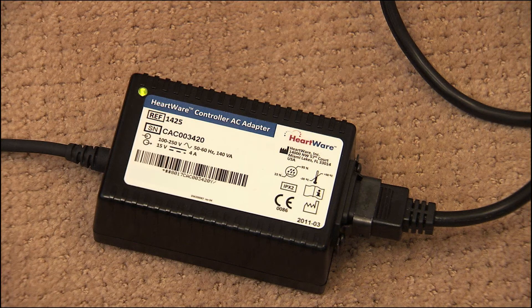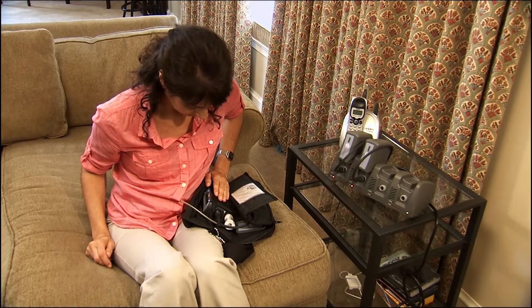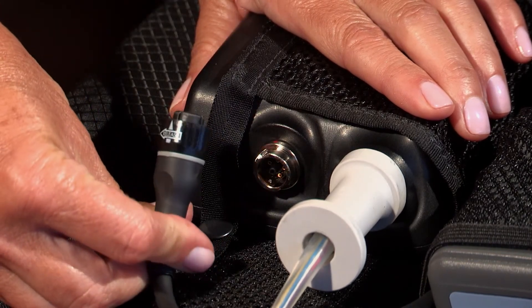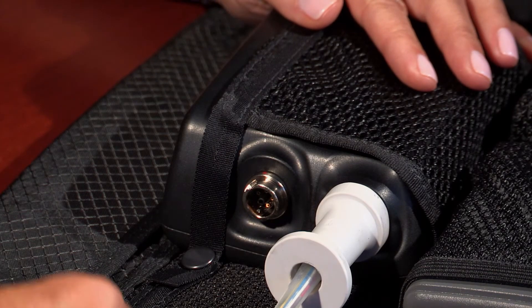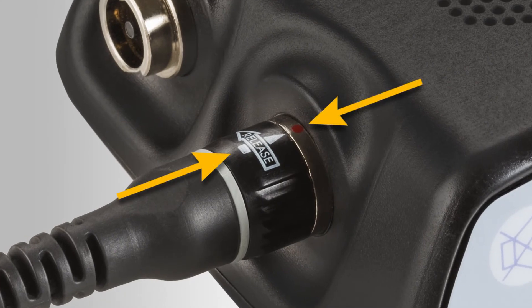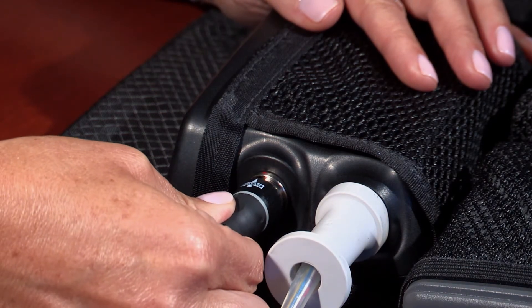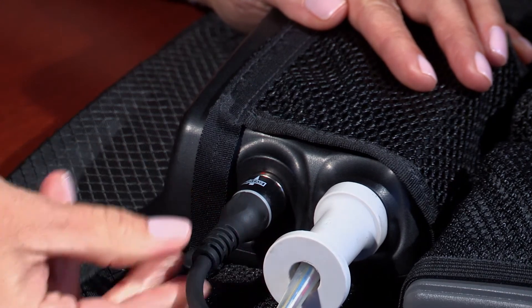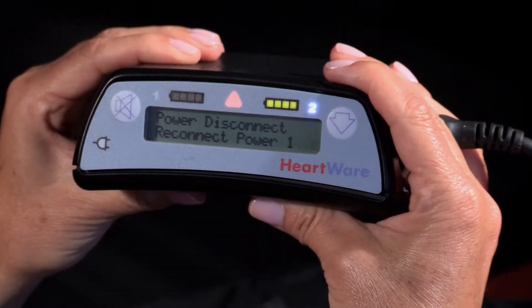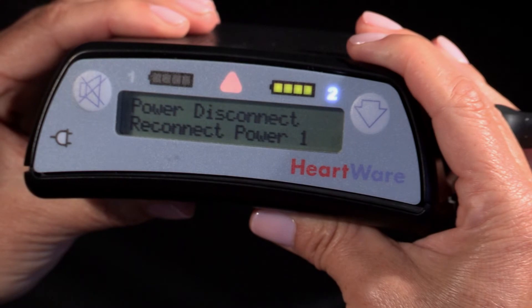If the controller is being powered by an AC adapter, you will need to change power supplies. To disconnect a power supply, grasp the power cable on the front end of the connector, turn the connector counterclockwise until it stops, and pull it straight out from the controller. To connect a battery, grasp the power cable near its connector, leaving the front free to rotate. Line up the solid white arrow on the cable connector with the dot on the controller. Gently push the cable into the controller — do not twist it, but allow it to naturally lock in place. A good connection will result in an audible click. Confirm the power cable is properly locked by gently pulling on the cable near the base of the connector. If another power source is not connected within 20 seconds, a power disconnect message will be displayed and an alarm will sound. Once a second power source is connected, the alarm will stop.